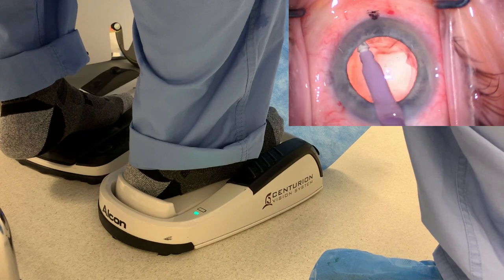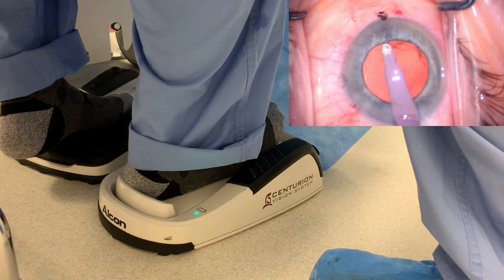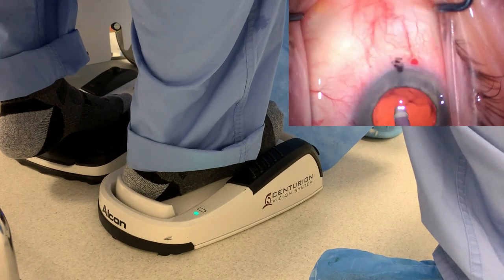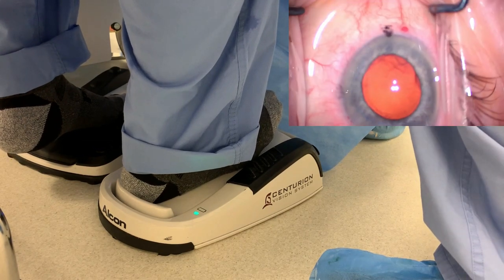Very little vacuum for any kind of capsule polishing. Look how I come up — inadvertently touched the iris. This is a good video to show you. I came off the pedal to release that. Cleaning up a little capsule here, a little polishing, coming out of the eye.